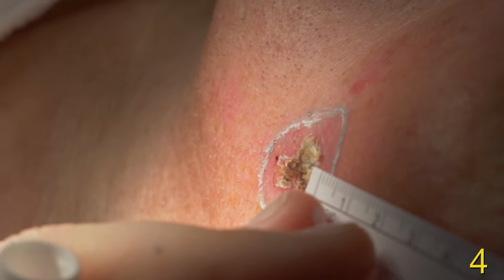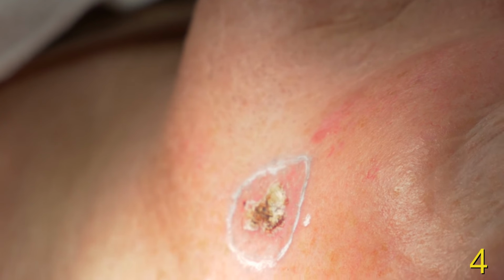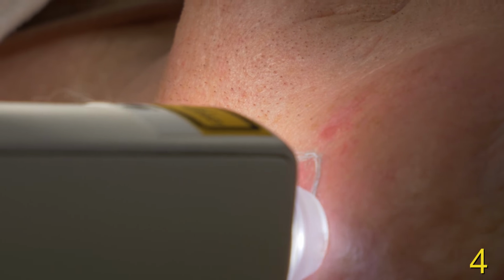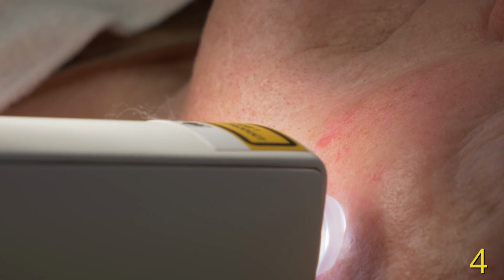Now we add 2 to 3 millimeters again of a safety distance. Because you've seen some tumours in the image. I've still seen some parts of nodules. Okay, so you've put a dot 2 to 3 millimeters. Yes. And then scan again. And for me, it's necessary to assess it again. Yes, okay. And then I draw the line.